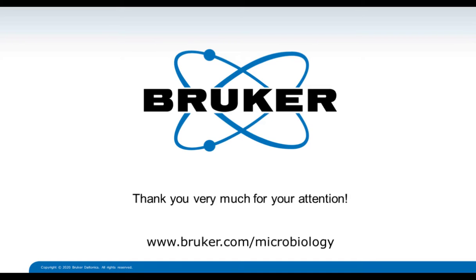Yeah, we did the first step now by delivering the species information to the IR Biotyper. So the species identified by the MALDI Biotyper is transferred. But of course, in future, we intend to expand that. You can just imagine all the information that we are generating on the MALDI Biotyper side, which might be interesting. As an example, a resistance profile that is stored in the MALDI Biotyper server, or subtyping information. All this, of course, in future step-by-step can be transferred and connected.